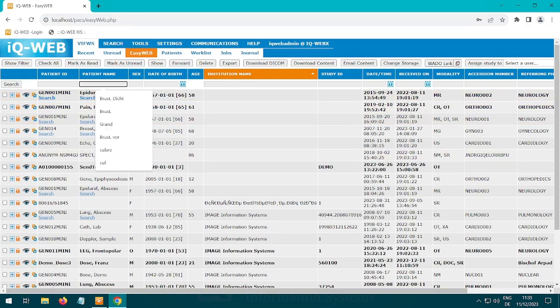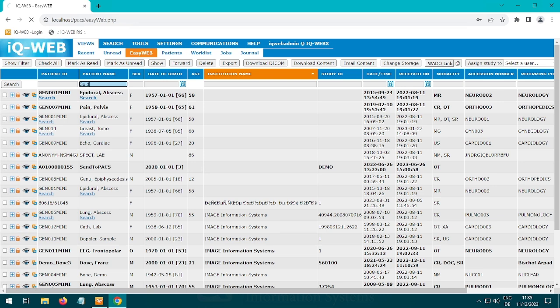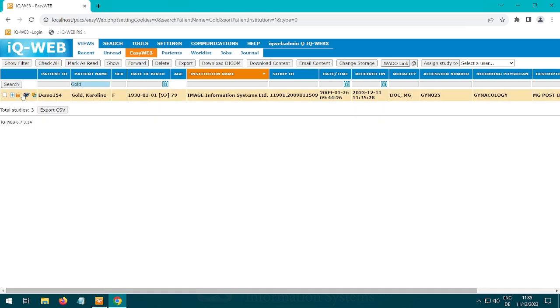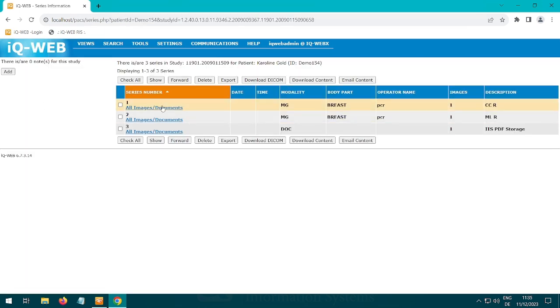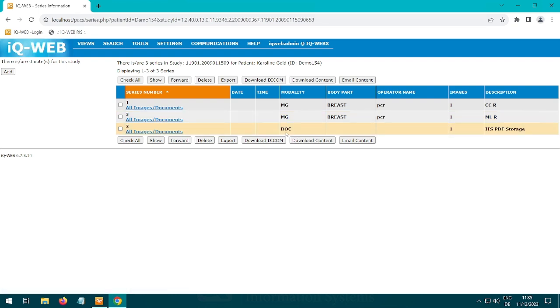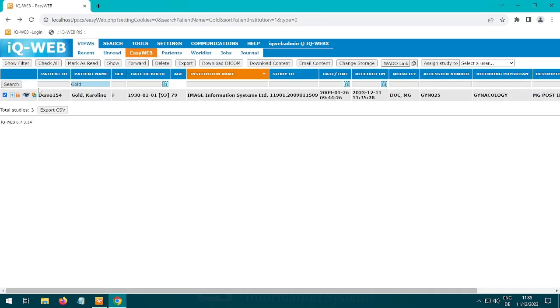Now open your IQweb. Log in there and search for the study. Select it and click on Wado link. Now you can send the Wado link with the study and the PDF report as usual.